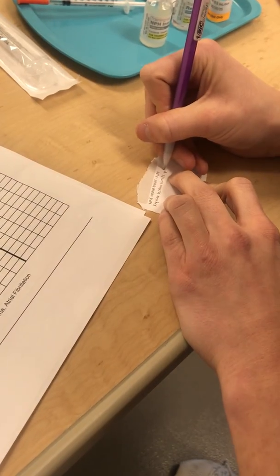Perfect. I'm going to make a label right away for this one. So what we have here is NPH insulin, 10 units of U100, and then we have regular insulin, we did 11 units according to the sliding scale, of U100.